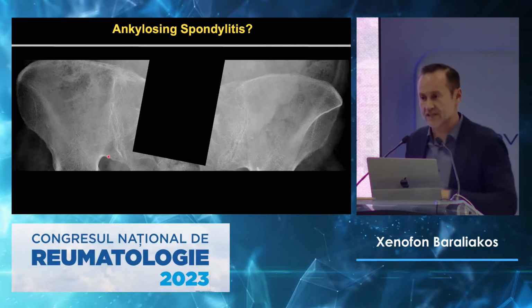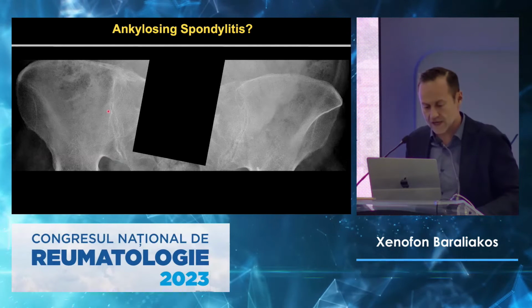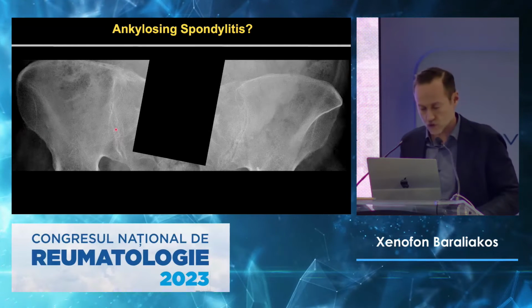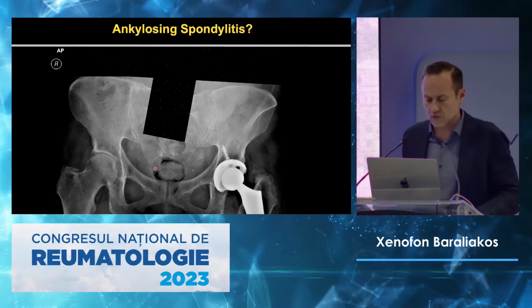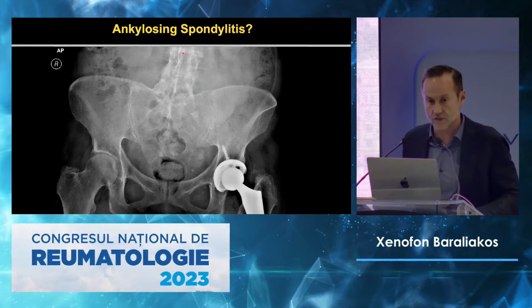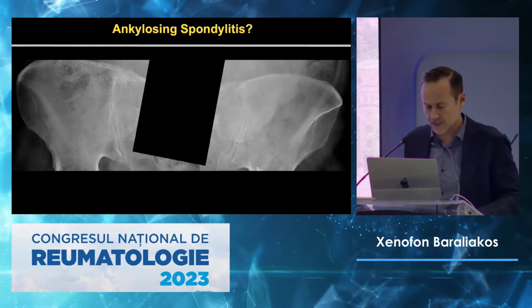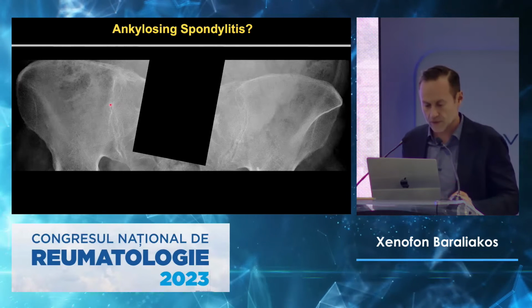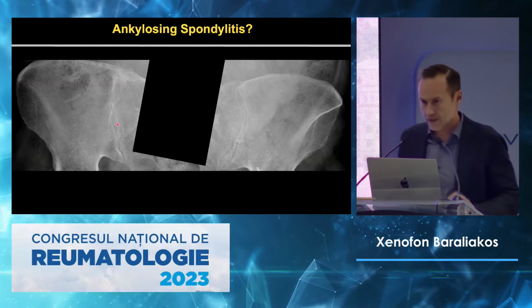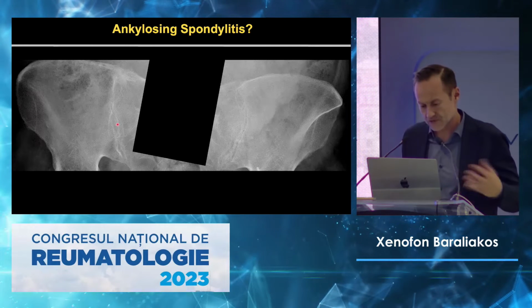The problem with X-rays is that they are not always showing everything properly. You may see that patient where you see the lines nicely. There's not big change in the width of the joint. However, if you see that patient, you will see that he has a complete ankylosis of the spine. So this is a complete bamboo spine. And the problem with that one is that the osteoporotic bone doesn't allow you to obviously judge on these lines very much. So it changes from very important to less important, what I showed you, this rule, the more severe the patients become.